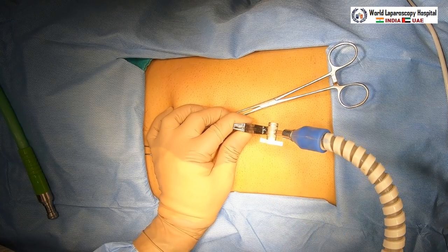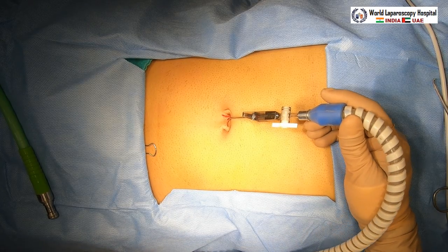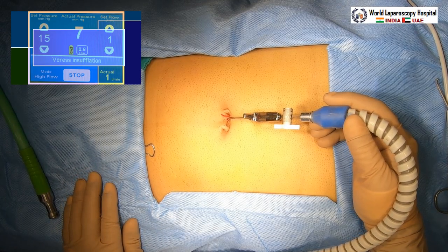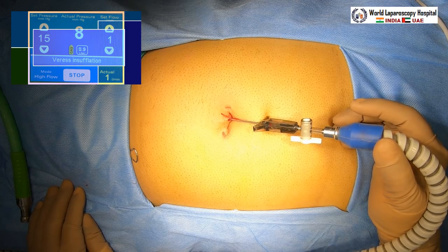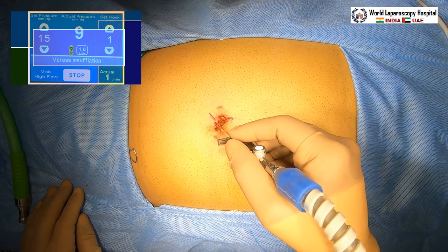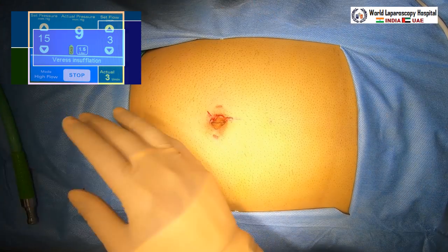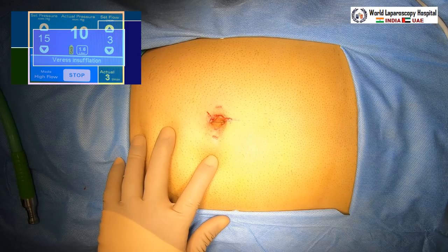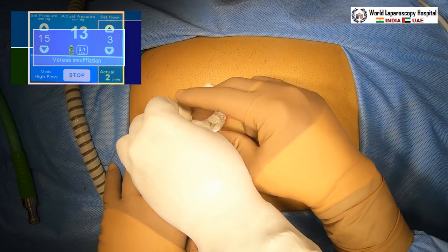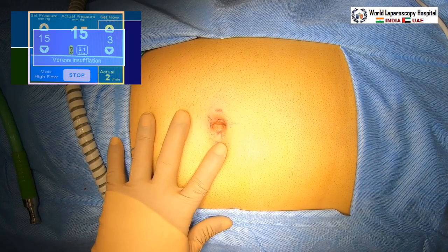We are using a CO2 warmer together with the insufflator tubing. Start the flow rate according to the principle: set pressure is 15 mmHg and the actual pressure rises slowly. The initial flow rate is 1 liter per minute; after approximately 1 liter of gas has entered, increase the flow rate to 3 liters per minute. Wait until the set pressure and actual pressure become equal, then enlarge the incision to approximately 11 mm.